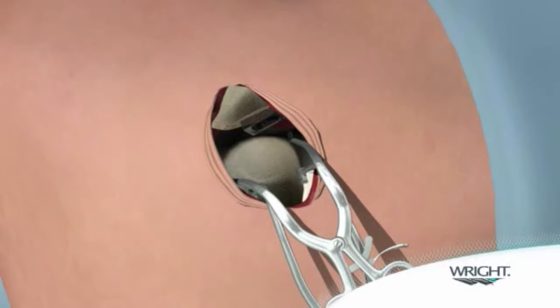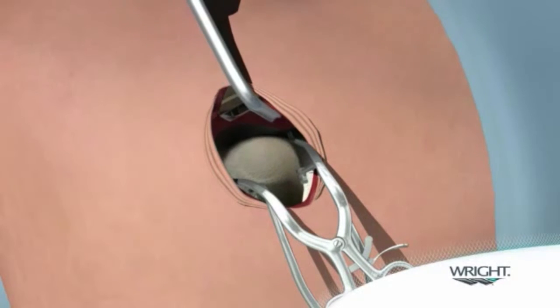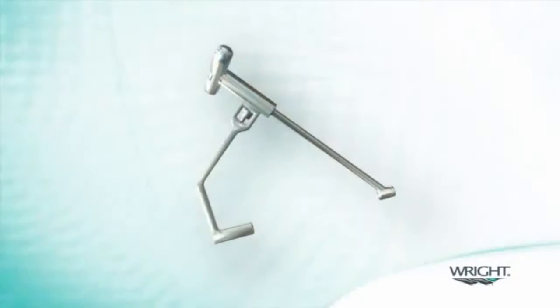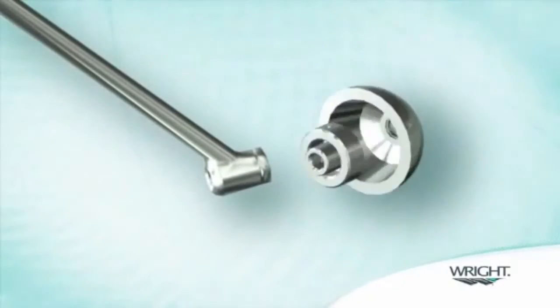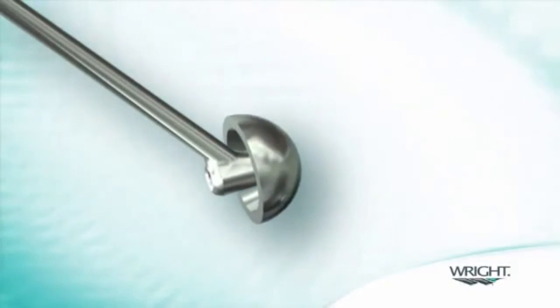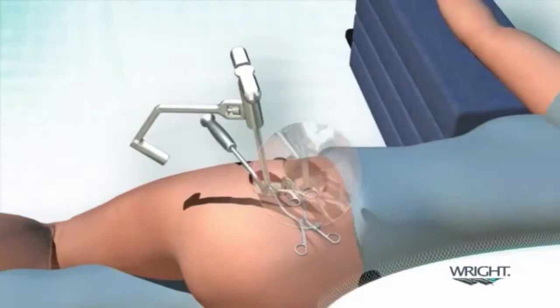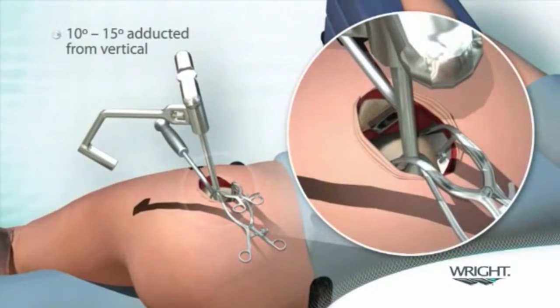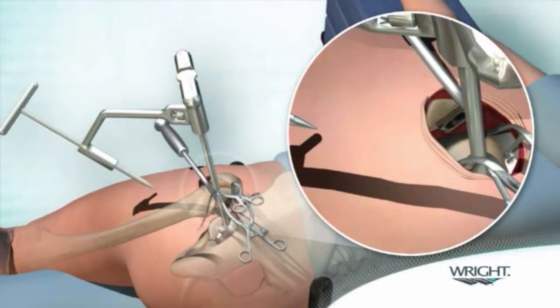The spiked Hohmann retractors are removed. The tip of the bone hook is inserted into the broach to retract the femur anteriorly, and the alignment handle, portal placement guide, threaded cup adapter, and trial cup assembly are seated in the acetabulum. With the top of the alignment handle perpendicular to the patient's torso and the shaft tilted 10 to 15 degrees from vertical to account for the pelvic tilt of the patient on the table, the blunt trocar with cannula is inserted until the tip is resting against the operative leg. At the point where the blunt trocar intersects the leg, a 1 cm stab wound is made horizontally.